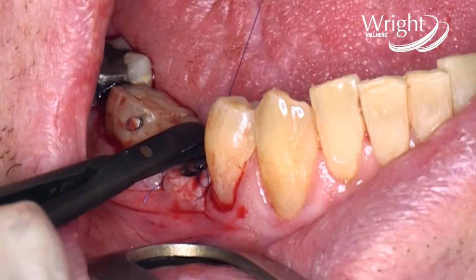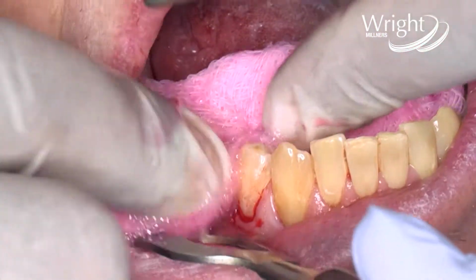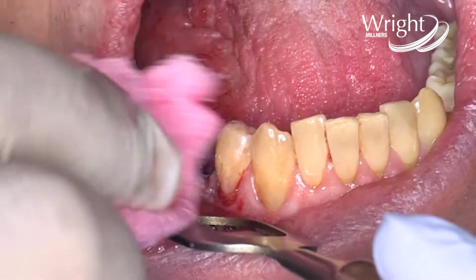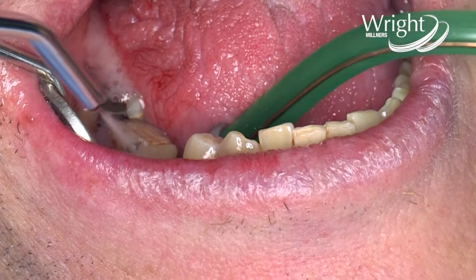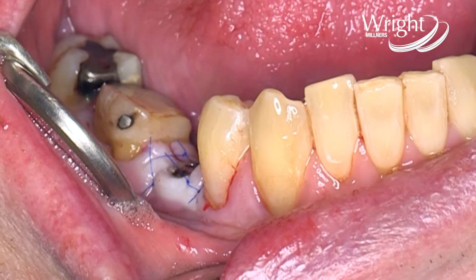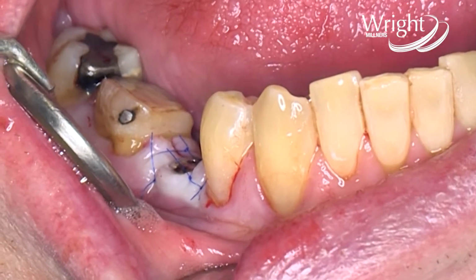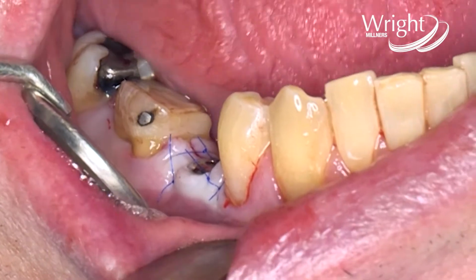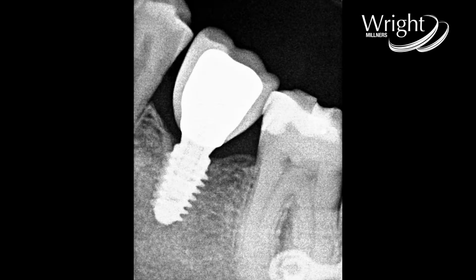Wipe it down with the abutment solution over the top to make sure you clean it nicely. And irrigate the area. The important thing I want to show you is, you see how nice and passive that is? See how the widest part of the stud is below the margin of the tissue. It's not standing above the margin of the tissue. That is actually critical when you're doing these, because otherwise you're not going to be able to get the right emergence profile for this situation.